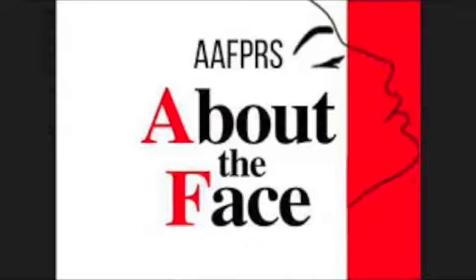Good morning. This is Alyssa Ovaitt here with Clint Humphrey to talk about our article, The Impact of Using Intraoperative CT on the Number of Surgical Approaches Used for ZMC Repairs. We are both facial plastic surgeons who tackle complex facial trauma at our institutions. And in brief, this project retrospectively reviewed practice changes over a decade before and after starting to use intraoperative CT to better assess reduction of ZMC fractures.